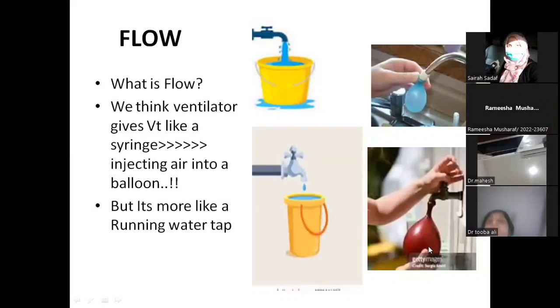And then after that, when it is filled to its limit, and we turn it upside down, the water will start gushing out. There will be a rapid fall, and that will be followed by a very little volume of water left inside the balloon that will start dripping drop by drop, and it will take some time for the balloon to be emptied fully.